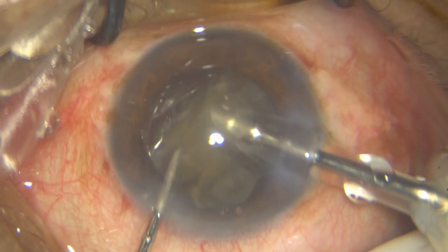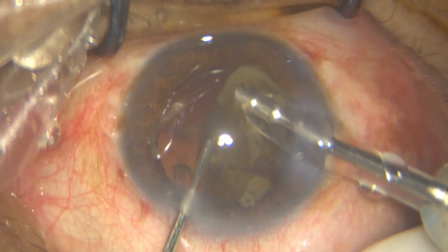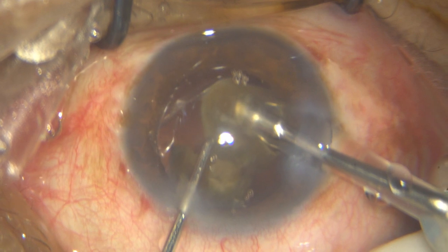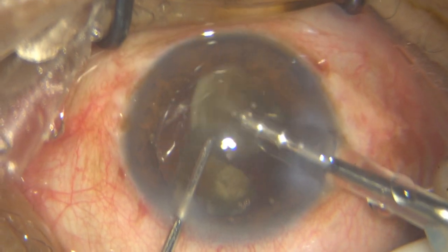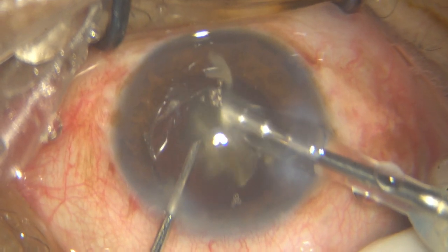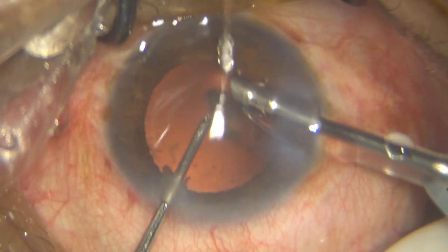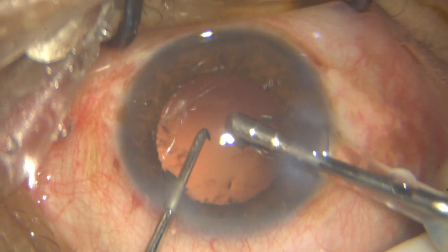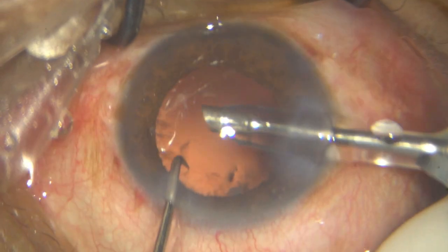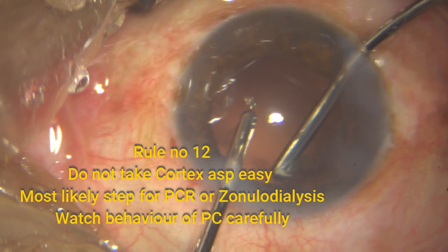Look how steady my phaco probe is. Very little movement. I just keep it in that safe zone, let the pieces come to me, and I have turned the bevel down. The bevel is not sidewards, it's not facing upwards. Never face the bevel upwards in a hard cataract. Do the case bevel down, and that's it. I've got out all the pieces. That's a bit left, usually gets stuck at that side port. You can get it out.